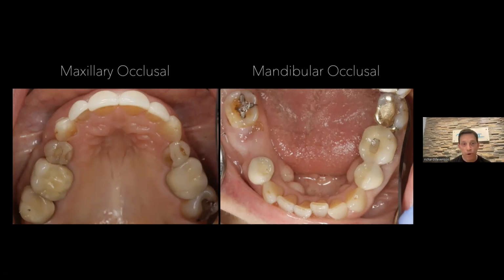But you look at the upper teeth, the canines look pretty straightforward, except there's some wear on the lingual of the canine. So when you look at those 4 teeth, probably tooth number 4 is going to be some kind of MOD onlay/veneer called a vonlay. And tooth number 6 is going to be more of a wraparound, almost like an entire tooth. It's going to wrap quite a bit on the lingual. On the other canine, it's going to be a slightly different design. It's going to be more conservative. And then on the final one, it's going to be a bit more like a crown.